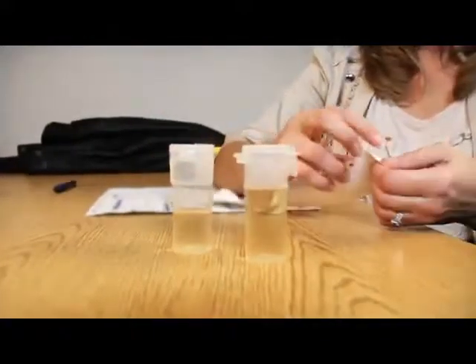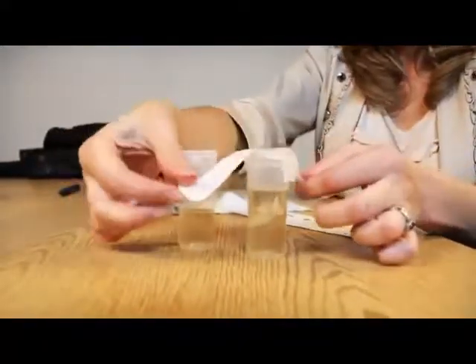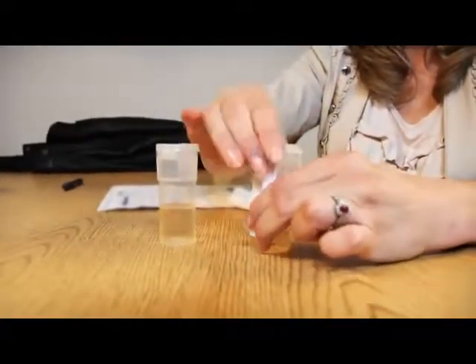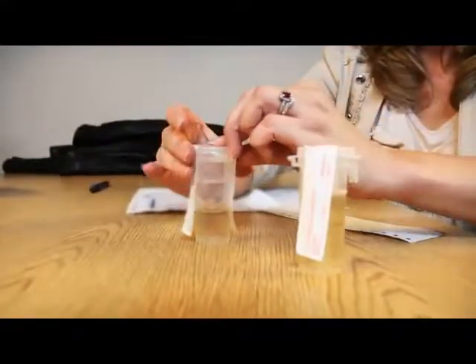Affix the specimen bottle seals to each bottle, ensuring that the seal labeled as A is placed on the primary bottle with at least 30 milliliters of urine, and that the seal labeled as B is placed on the bottle with 15 milliliters of urine.